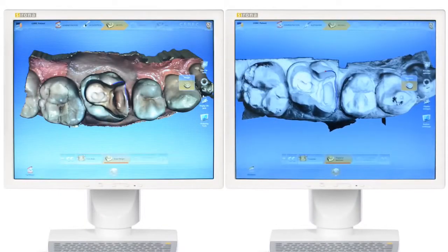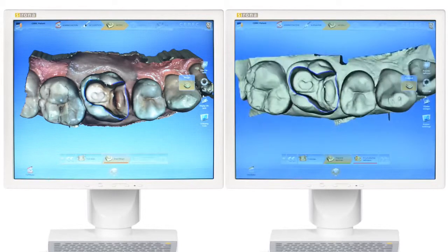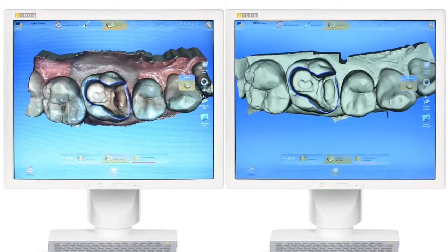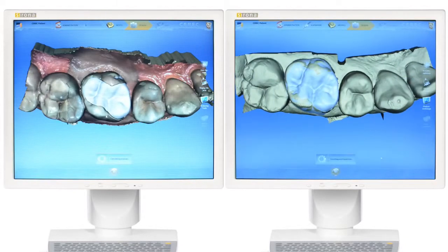After scanning is complete, the workflow for both cameras is essentially very similar. Virtual models created from Omnicam images are full color, an advantage for patient communication. With a single click, the biogeneric proposal with natural occlusal contacts is automatically calculated.